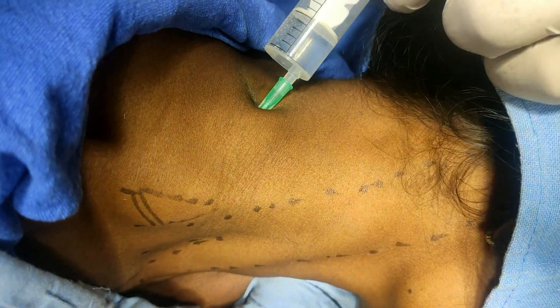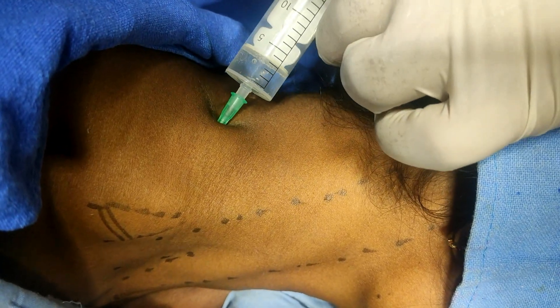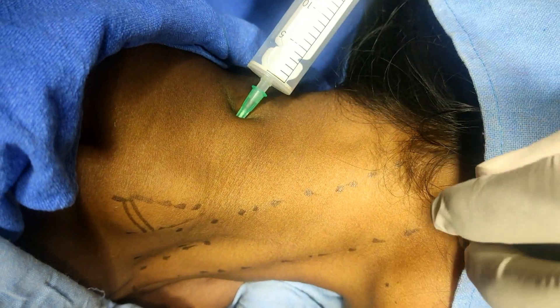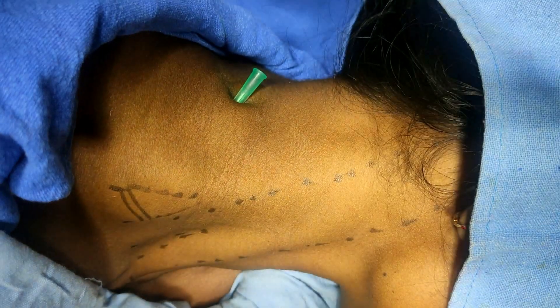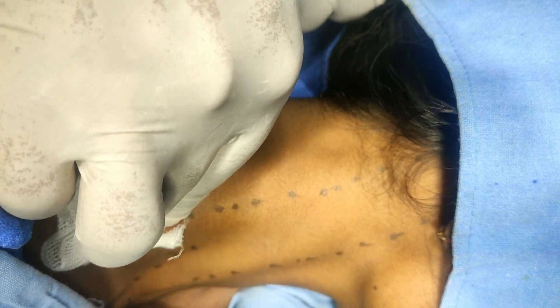I have used 0.36% lidocaine and the solution is buffered, so there should not be any burning sensation during injection. You can notice the amount of bulging here. The total volume I have injected is 20 ml. Now the block is complete. Just removing the needle — there should be minimal regurgitation of fluid. Remove it and then massage this area. The block is complete.